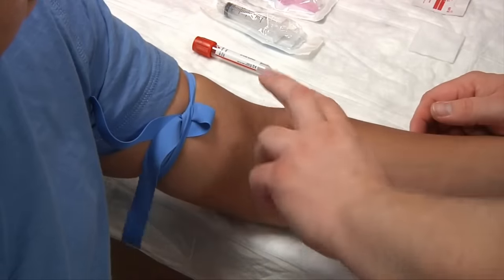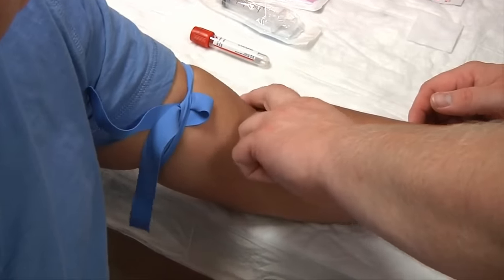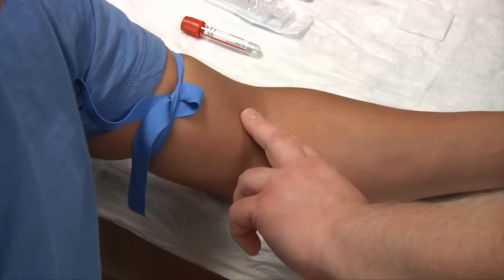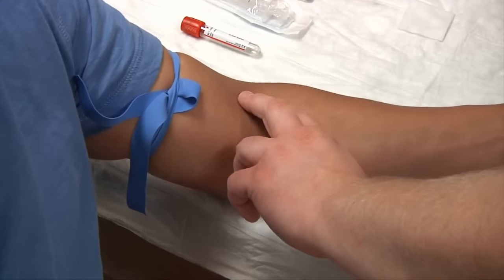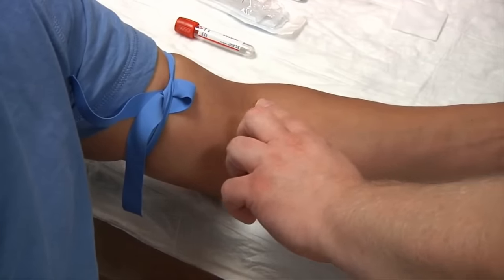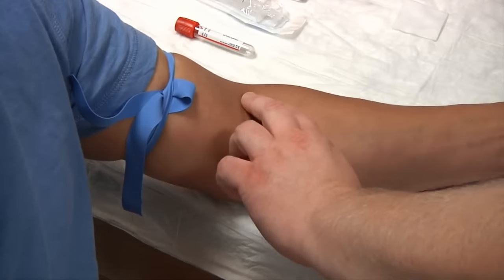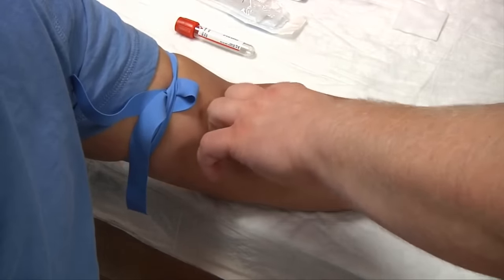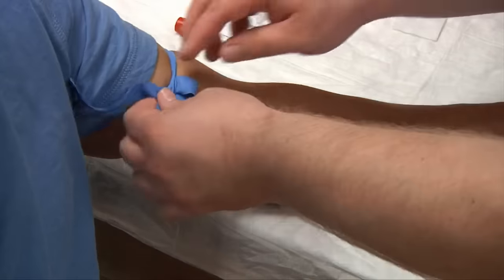We're going to palpate with our two index fingers of our non-dominant hand. We may need to ask our patient to make a fist. I've found my vein of choice — let's go ahead and landmark. Release.